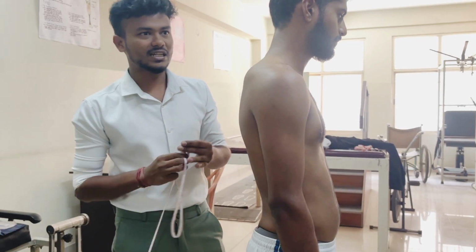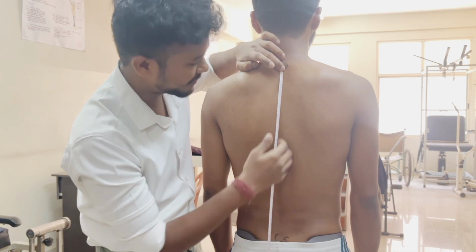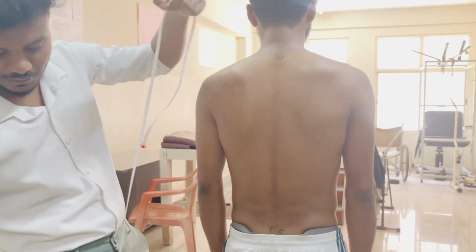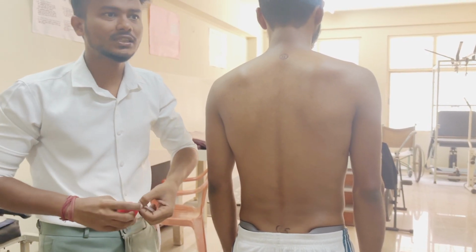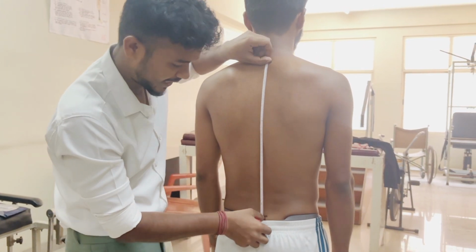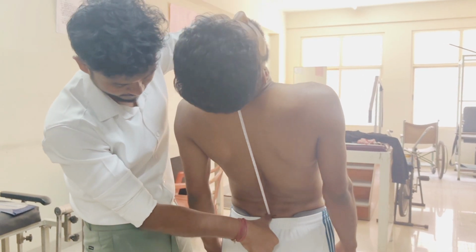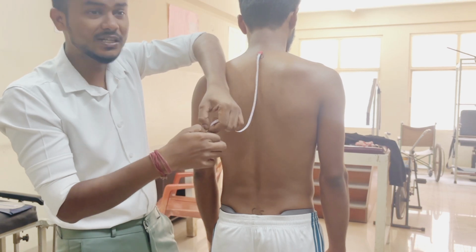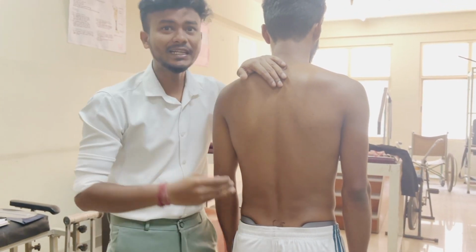Now we will see extension. Extension is also the same. First we are going to take the measurement between these two spinous processes. After that we ask the patient to go for extension. So here I mark. Now I'll ask the patient to come to extension. When the patient comes to extension, the distance will reduce. How many centimeters the distance reduces, that is his thoracolumbar spine extension.